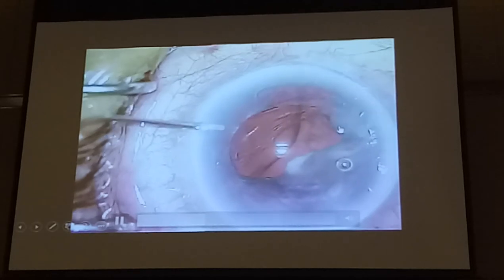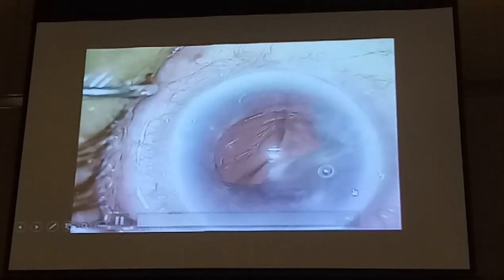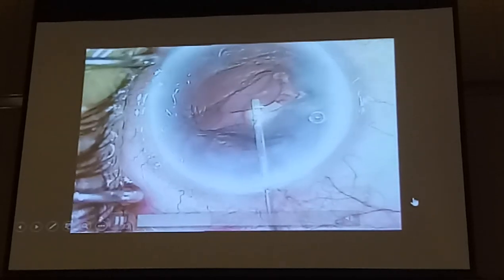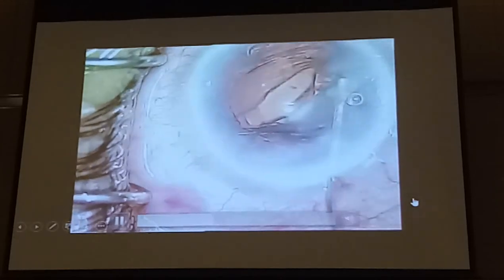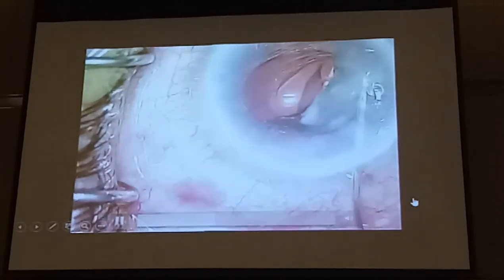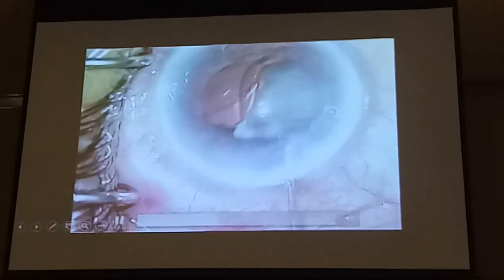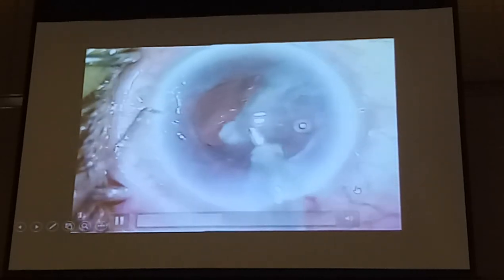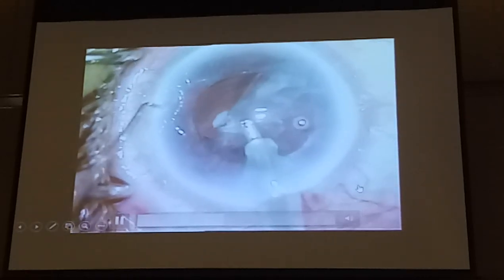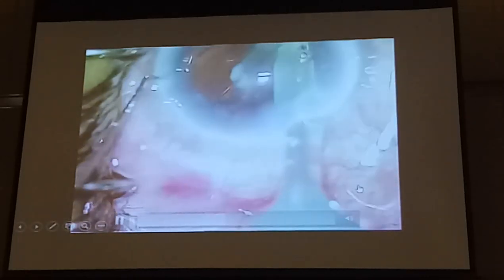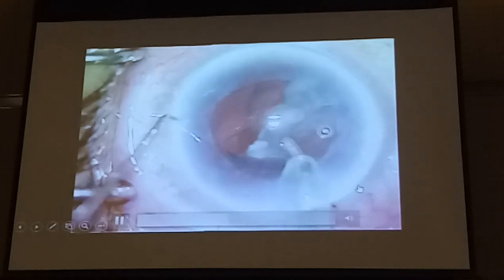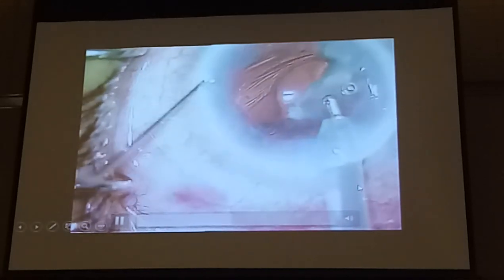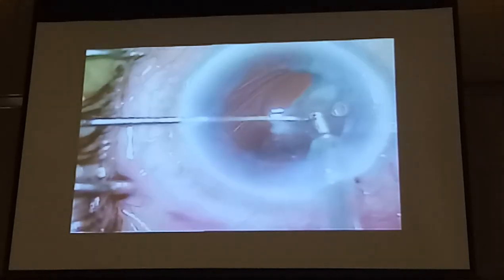Why did it suddenly extend like this? Can anyone tell me? In fact, at the time when I was putting in the viscoelastic, it had not really ripped yet. But I thought maybe I'll viscodissect this off. So why did it extend? Look — it's extending more and more.